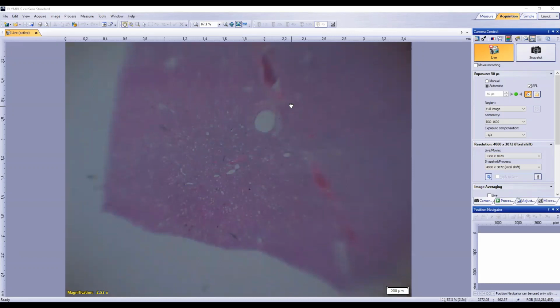So can we tell at this power whether they're lymphatic specifically? Not really, we can't. But the fact that they're just around the bronchioles or larger airways, and there are no red blood cells within them, I would just assume they're lymphatics.